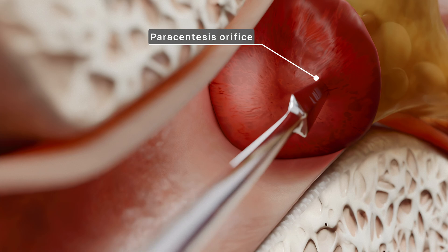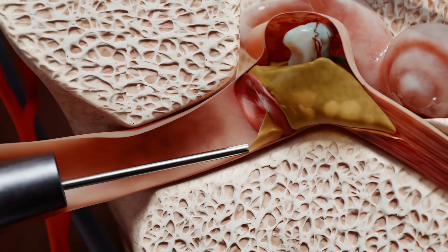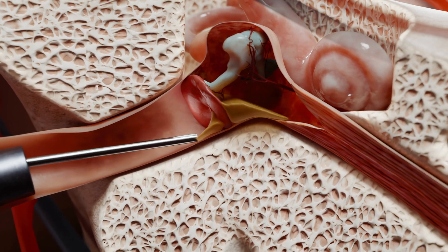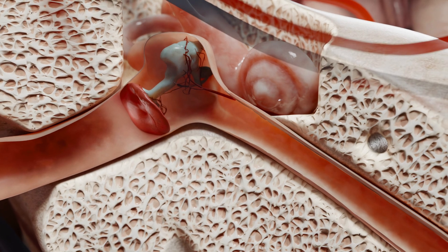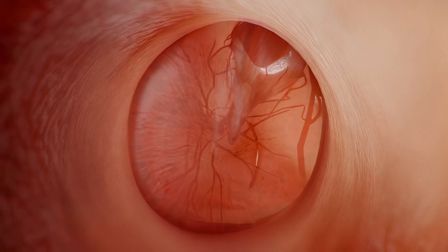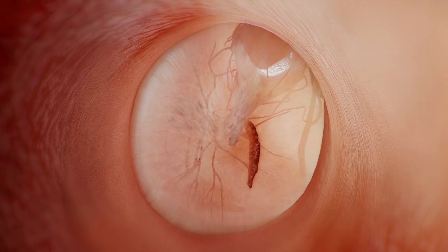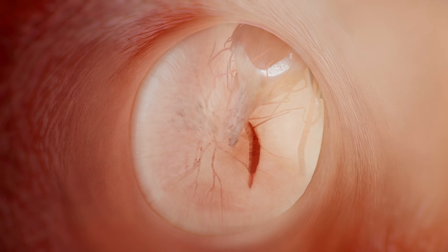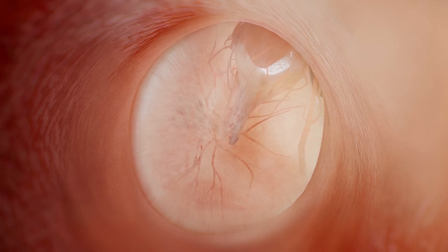The incision ensures the outflow of purulent contents from the tympanic cavity. Evacuation of exudate promotes a rapid decrease in pressure, alleviates the pain, and prevents any possible complications. Once the tympanic cavity is debrided, the inflammation subsides. Subsequently, the eardrum regenerates due to the proliferation of epithelial cells and restoration of the fibrous layer. In uncomplicated cases, complete healing of the perforation hole occurs within one to two weeks and scar tissue does not form.